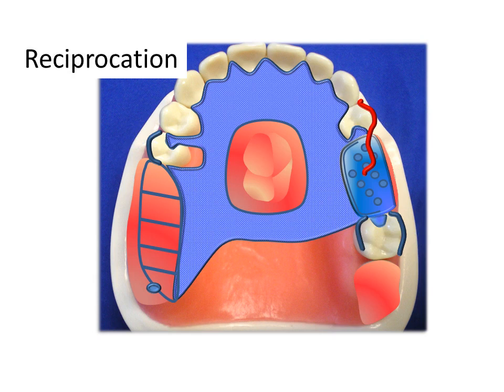Okay Dr. Goon, last but not least we need to reciprocate these clasps. Marie, encirclement of the abutment is important to make sure the retention is reliable. In this case we have 3 types of reciprocation. On number 4 we have the distal proximal plate and mesial vertical bar minor connector. When using the mesial rest, it's important to avoid things that could shift the fulcrum line distally, such as plating. On number 12, we have no such concern, and use the lingual plate for reciprocation.